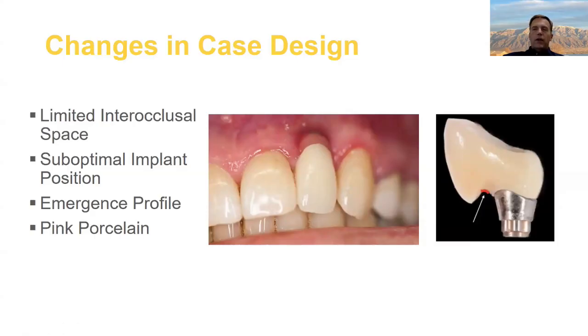So pink porcelain, the more you use, the better it looks. Like a full arch of pink porcelain with a good transition line, like a zirconia all-on-X or something, that can look really nice. Usually single teeth like these don't look as awesome.